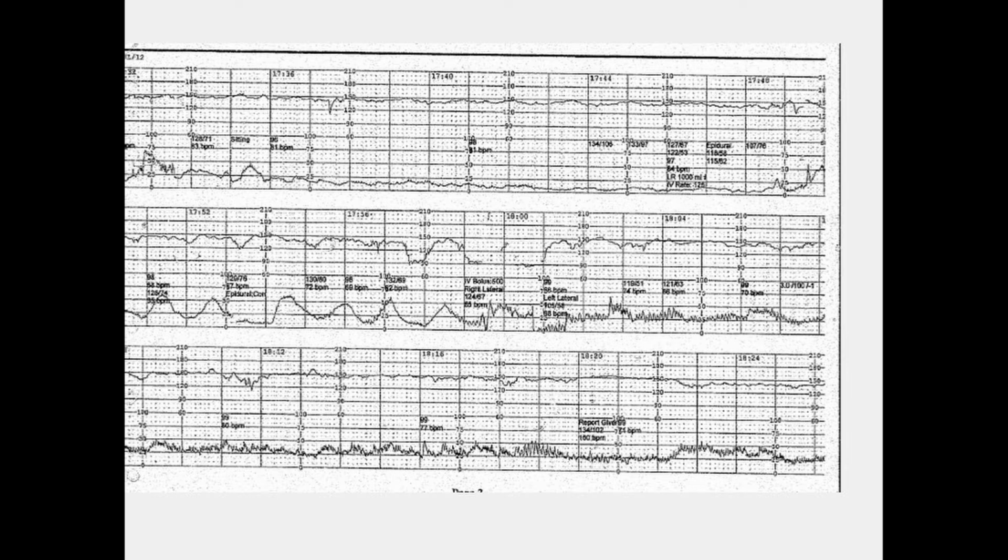So category 2 fetal heart rate tracings, if we leave them alone and don't intervene, this is what they do. They get worse. So what do we do if we have a category 2 fetal heart rate tracing? Something, right? We do intrauterine resuscitation, and the biggest thing is we notify everybody, and we get an operating room ready in case we need it.